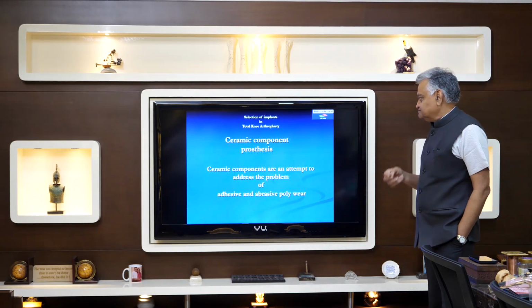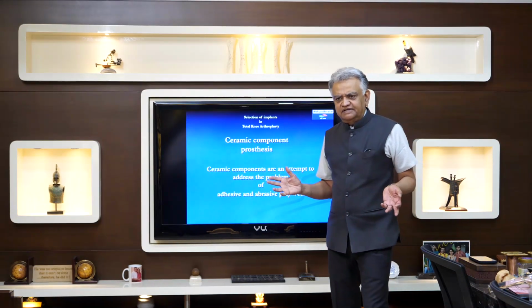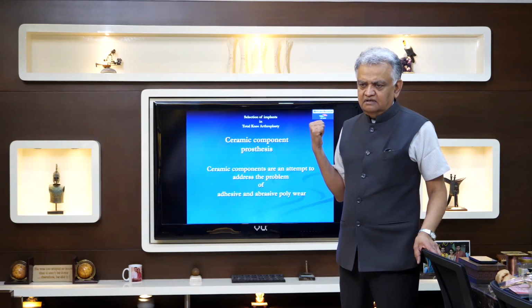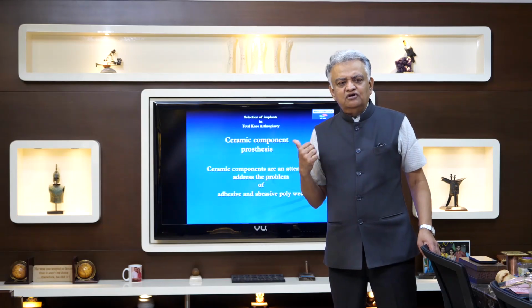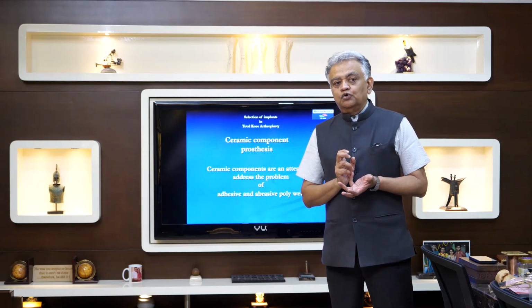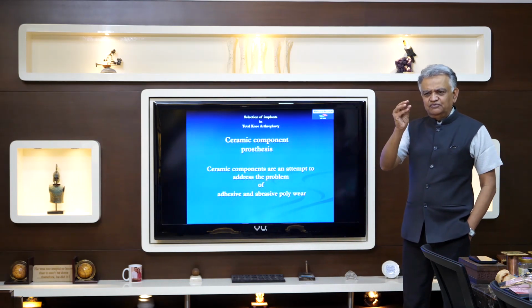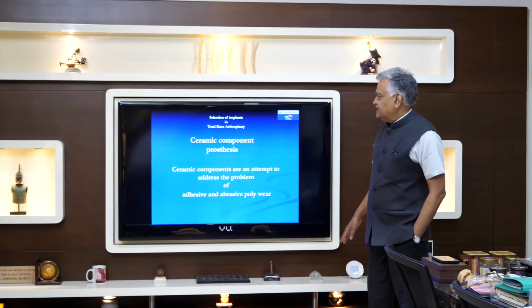Next please. And now these are the last two slides. Ceramic. We won't go into the details of ceramic. In India, we have just had a launch of the all ceramic knee in the south a few weeks ago. Ceramic is all more about material characteristics, how they are less prone to wear, just like ceramic on ceramic in the hips, right? But it's still so embryonic in its stage that I won't occupy time with it today. Next, please.